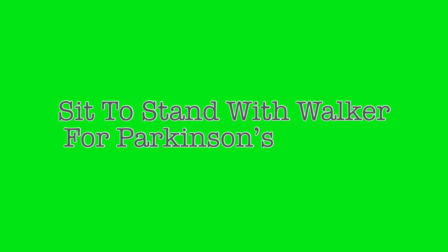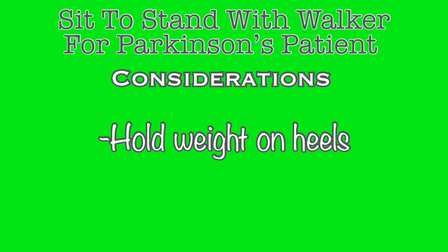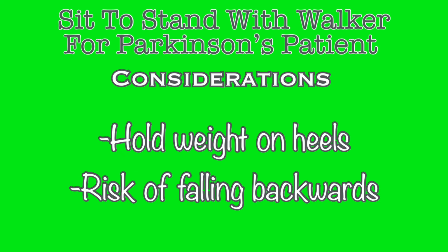The next transfer we will demonstrate is the sit to stand using a walker, but with a patient that has weakness related to Parkinson's. Patients with this diagnosis tend to hold most of their weight on their heels. They are at a higher risk for falling backwards because of how they distribute their weight. They can transfer safely with a walker, but it is important to understand the nuances of assisting these patients to keep them and you safe.